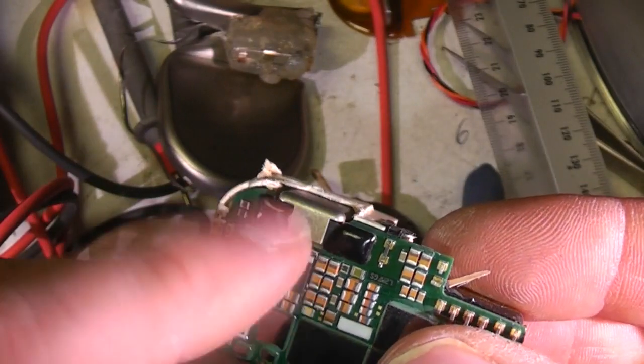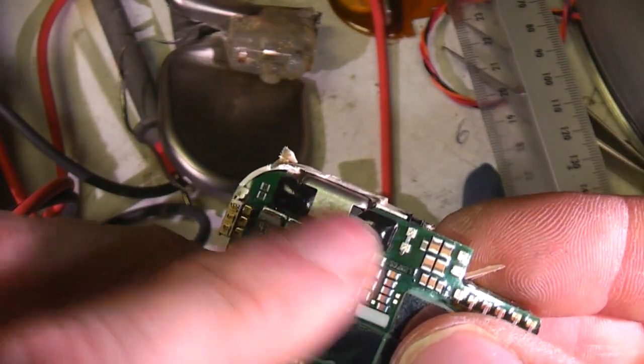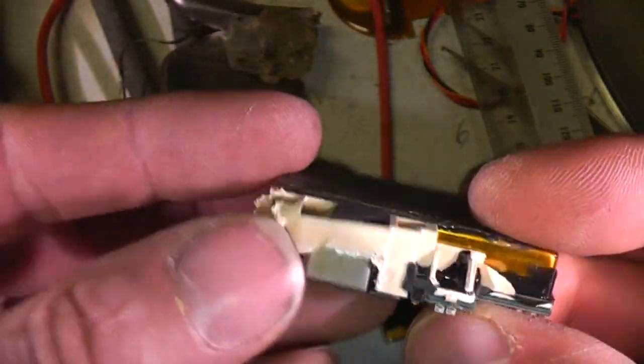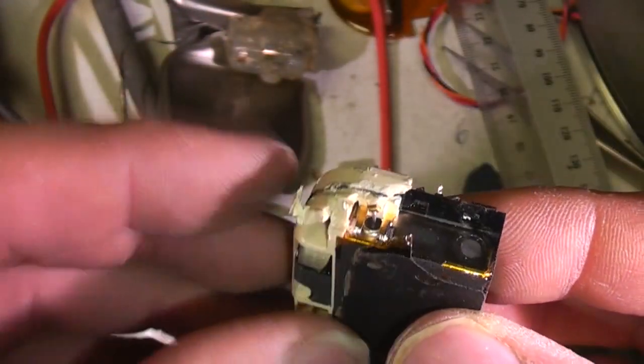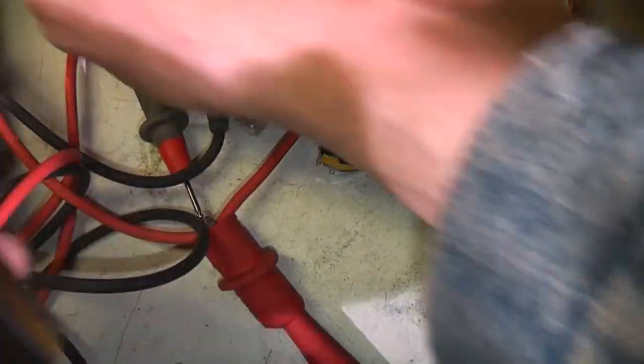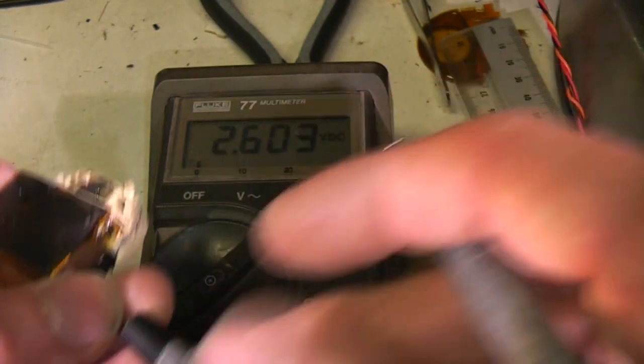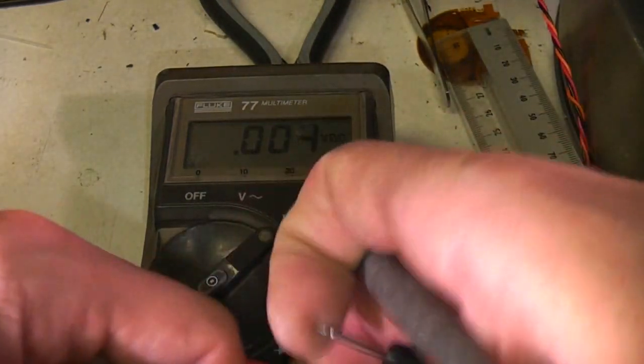There's another piece here, I'm pretty sure that's going to be the transformer for stepping up the voltage. It's in a shielded metal can. I'll tell you, this is the battery, that's the terminal coming out of the battery. Measures 2.6 volts. I'm guessing this is probably a lithium battery of some sort.